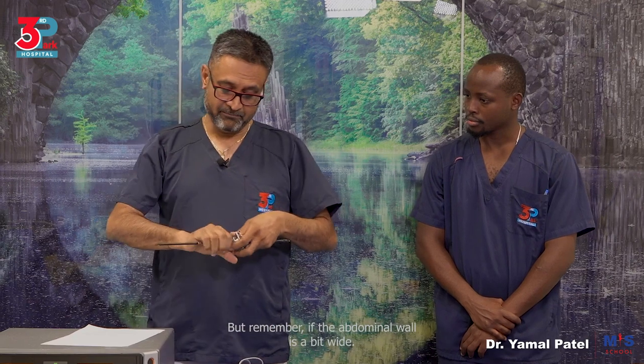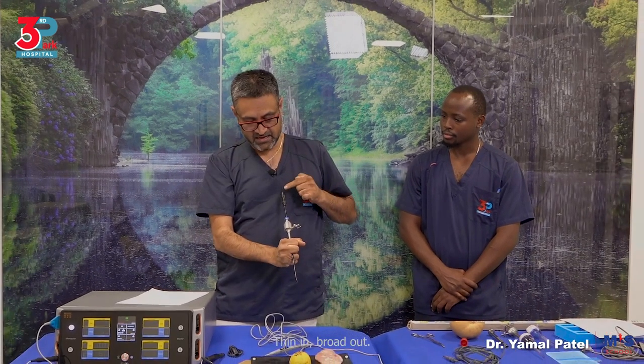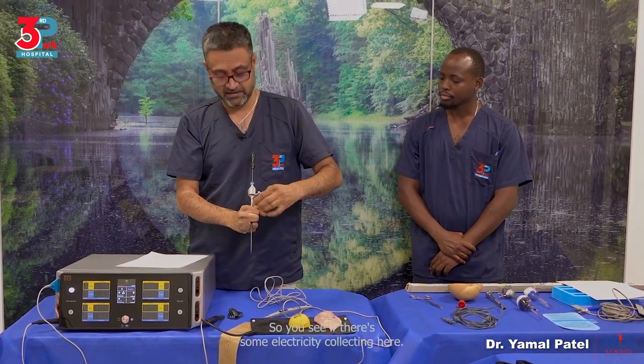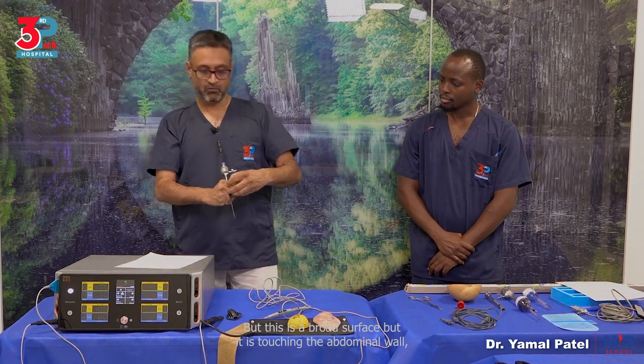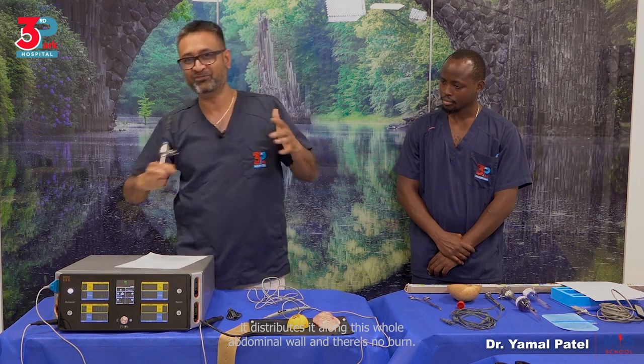But remember, if the abdominal wall is a bit wide, then you're talking of thin in, thin out, burn. Thin in, broad out. So you see if there is some electricity collecting here, but this is a broad surface that it is touching the abdominal wall. It distributes it along this whole abdominal wall, and there is no burn.